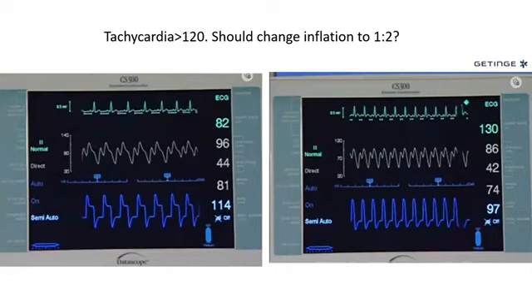Tachycardia is useful up to a certain point. It increases contractility and stroke volume up to a certain point. This is what we call the Bowditch or Treppe phenomenon. That certain point is about 110 to 120 beats per minute in patients with heart failure. Beyond 110 to 120 beats per minute, the tachycardia will reduce the intrinsic stroke volume, which will reduce augmentation because less volume is ejected in the aorta. Therefore, less volume can be displaced by the balloon pump during augmentation, and therefore you get less augmentation.